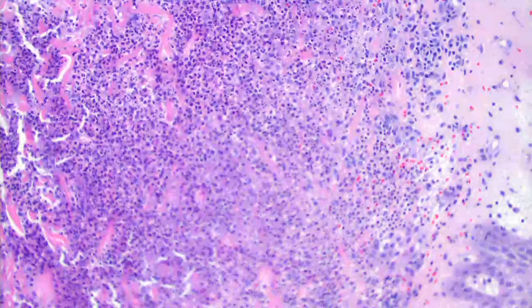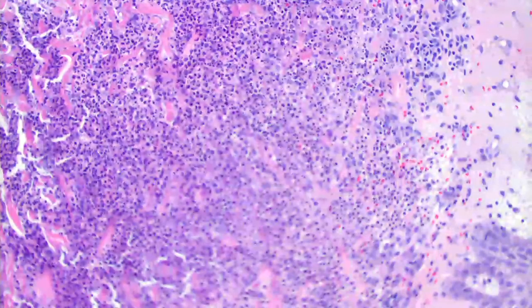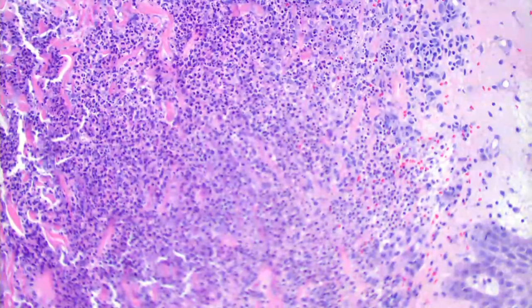There's kind of 3 or 4 histologic close identical twins, if you will. They're not exactly, but they all have dense diffuse infiltrates with relatively abundant neutrophils like this. So there's pyoderma gangrenosum, Sweet's. What are a couple of others that fall into that category? Leukocytoclastic vasculitis. Possible. What kind of leukocytoclastic vasculitis gives you pustules, neutrophils predominantly?